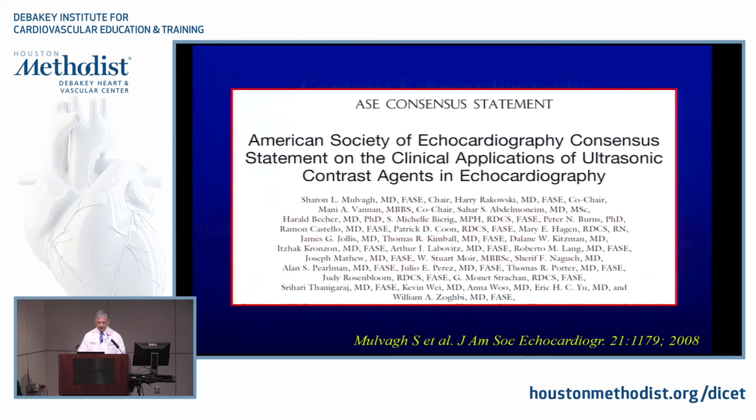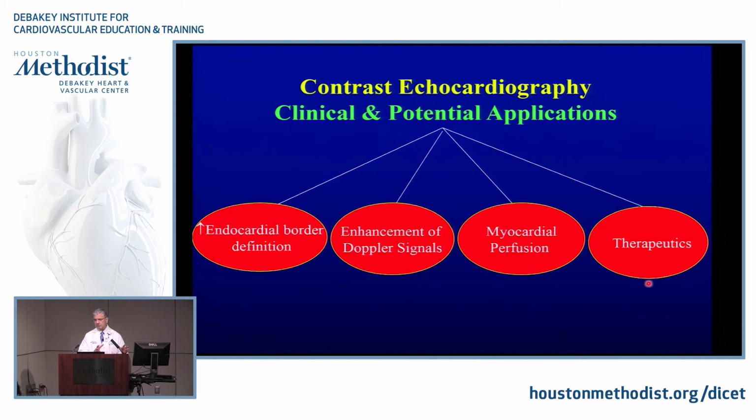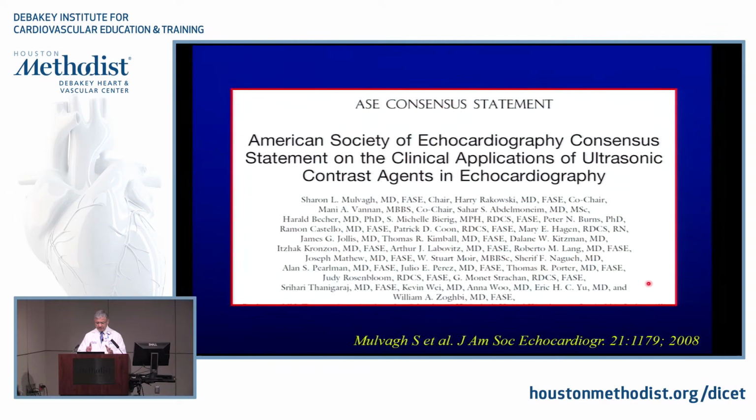The first one on the left is the clinical indication currently in the United States for contrast: improving endocardial border definition, particularly if you have two or more segments that are not well seen. Enhancement of Doppler signal is not an indication, although we do it. Myocardial perfusion is still out there, and we can talk briefly about it, because we've done a lot of work on it before. Therapeutics, believe it or not: thrombolysis enhanced with contrast and ultrasound. There is a great review, still current, from the American Society of Echocardiography on the applications of contrast. Take a look at it; it goes beyond the clinical indication for contrast and whatever we could do with it.